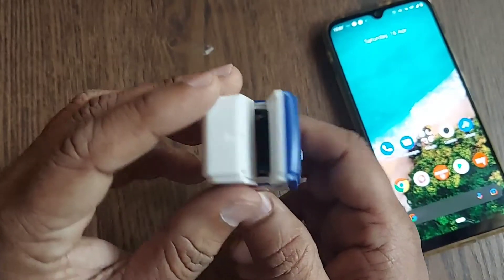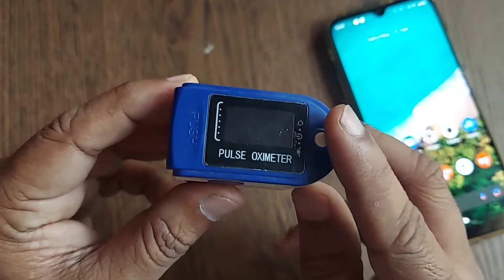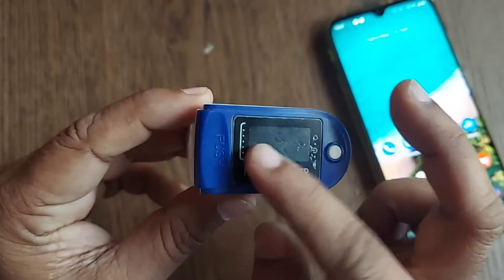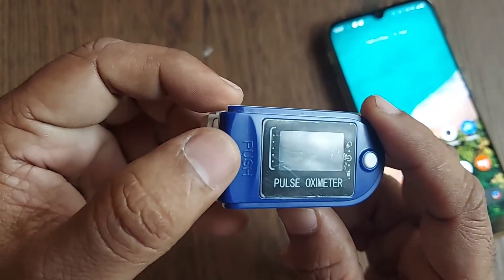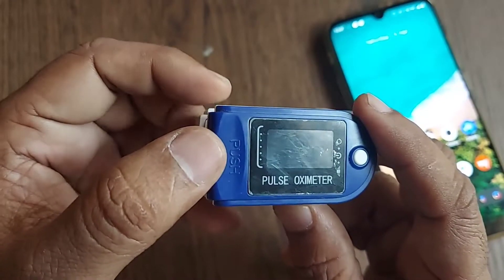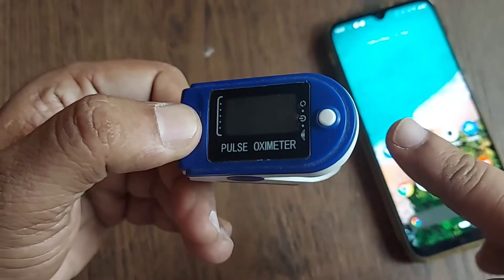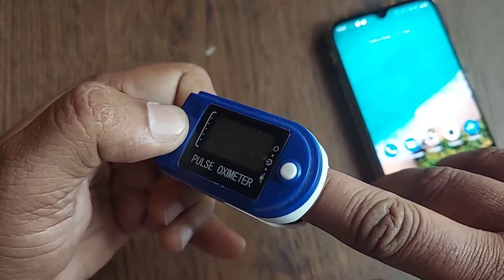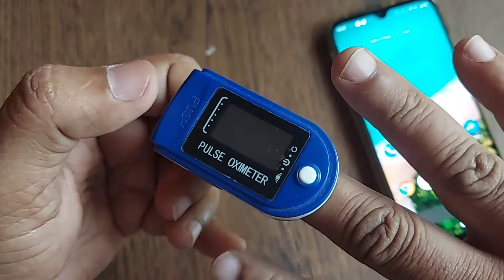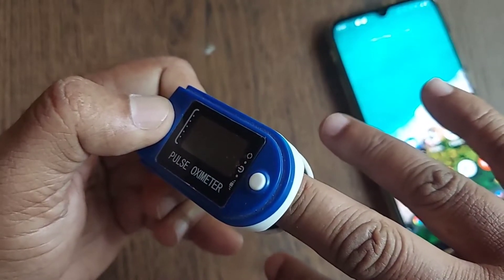On the front side, we will have a power button which needs to be pressed so that the power will be switched on. Thereafter, we have to push this — it is written as 'push.' After powering this device, we have to push and place our middle finger for accurate results. You can measure with other fingers, but the middle finger gives more accuracy.